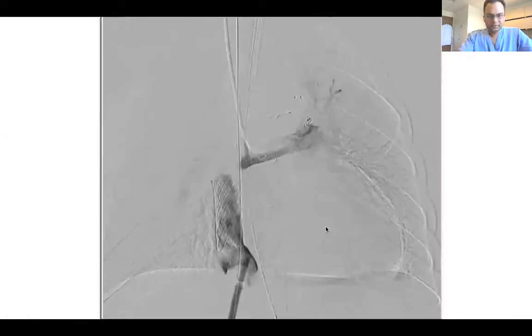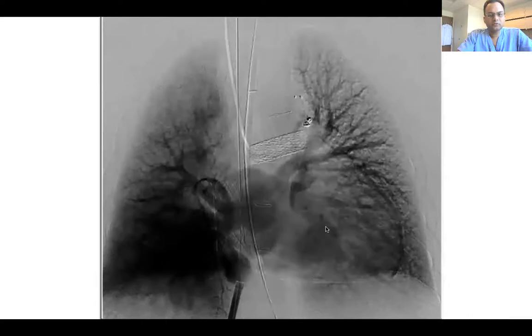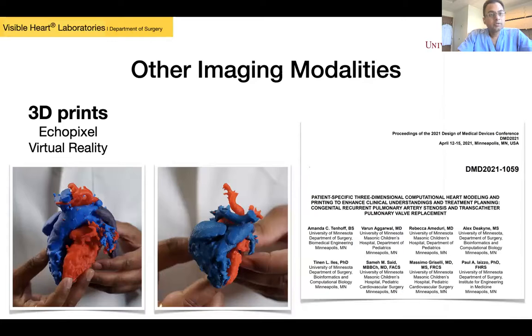This patient underwent successful placement of stent in both the left pulmonary artery as well as to treat some stenosis or narrowing in the Fontan conduit, and it went uneventful without any bronchial compression. So again, this pre and peri-operative imaging in the form of either advanced CT scans or MRIs, as well as rotational angiography, was very helpful in both these cases.